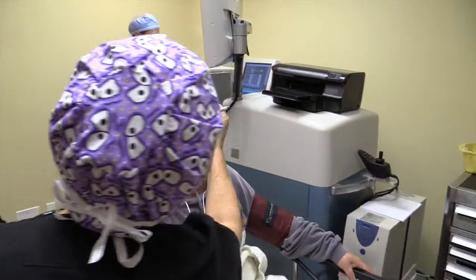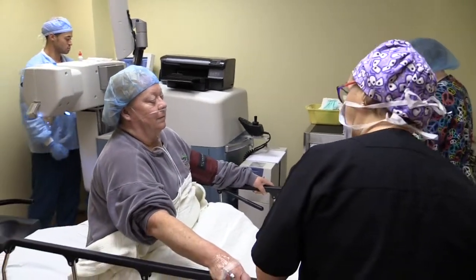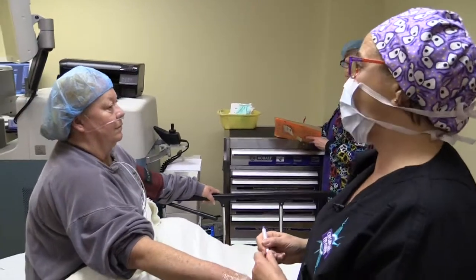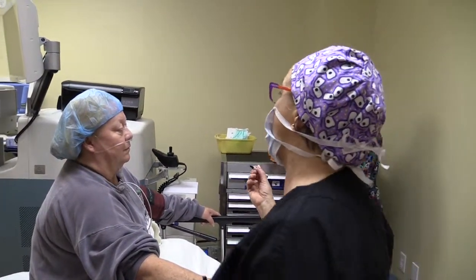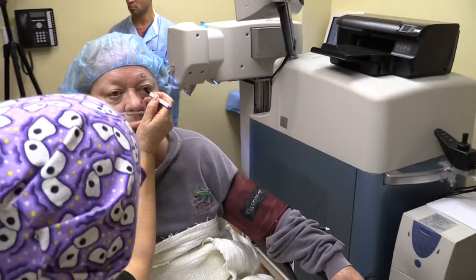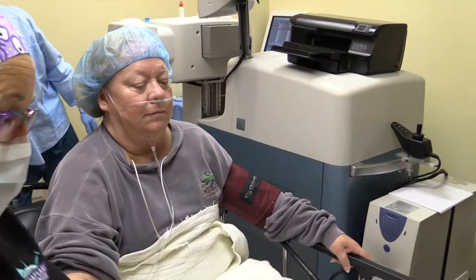The first thing that's really important about any surgical procedure, whatever it is, is to make sure you've taken the time to assure that it's the correct eye that we're doing and that your patient agrees, that you agree with your surgeon. The second thing when we're doing eye surgery here, because we're doing a new technology with femtolaser, we're going to be able to correct her astigmatism. In order to do that, I'm going to first have her in a sitting position where I'm going to exactly mark to line up that eye at its top and its bottom, what's called the 90-degree mark. The reason we're doing that is that's going to serve as a reference point for all the rest of our treatment plan.